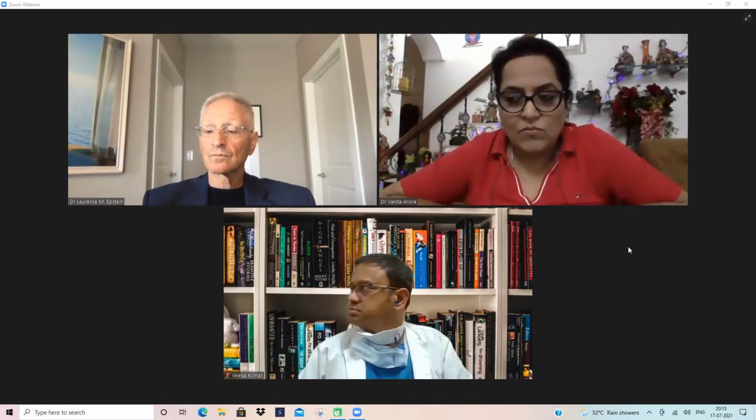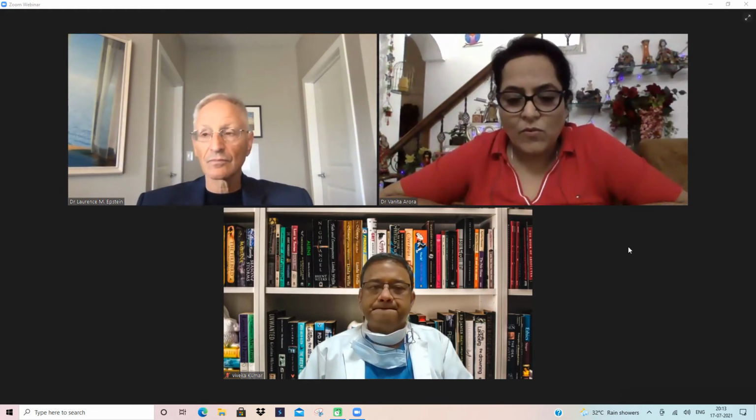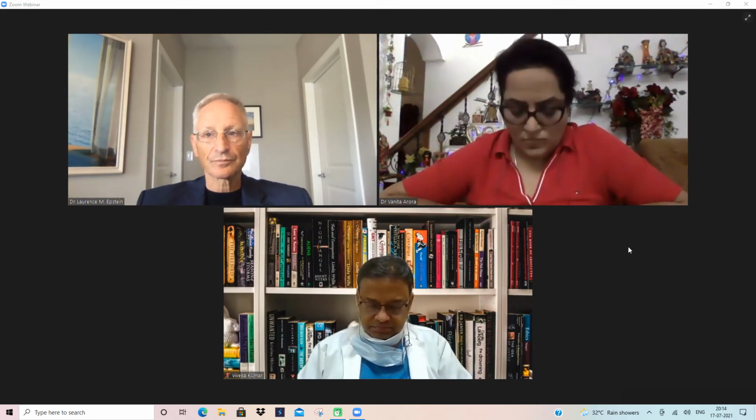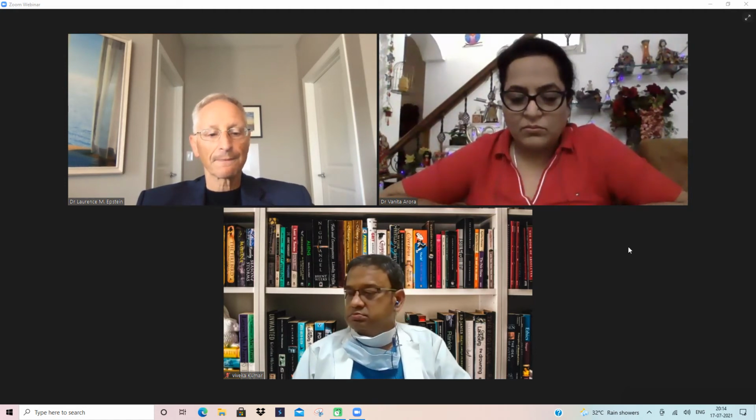And so that's what we had to do with the Micra AV, where we had to do a considerable amount of work changing the electronics to process that accelerometer. Instead of doing it in software, like we're doing in the MARVEL 2 study, in the Micra AV it's all done in special purpose hardware that can be done very efficiently. And so unfortunately, that upgrade just from a longevity perspective isn't very feasible.